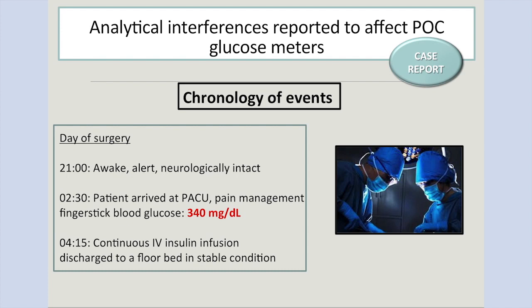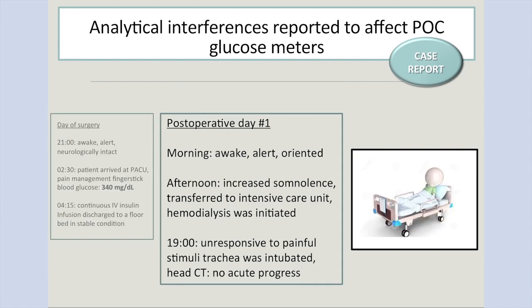And at 4:15, they started IV insulin. That's a high enough glucose to warrant that. Patient's discharged in stable condition. Next day morning, everything seems to be fine. Afternoon, starts to get a little drowsy, increased drowsiness, transferred to ICU, and then hemodialysis was initiated.